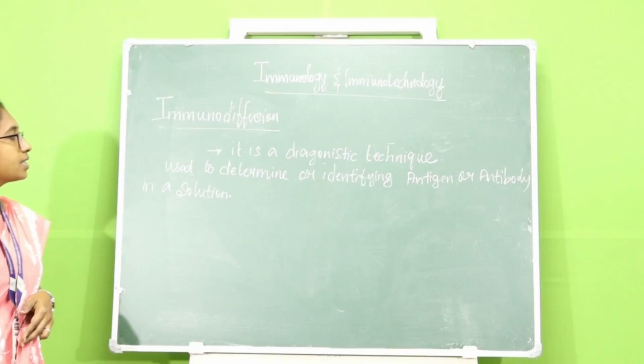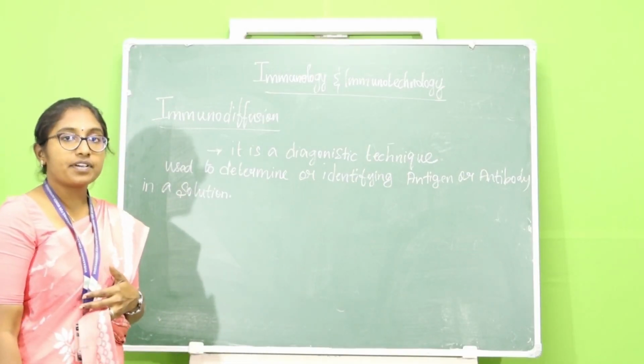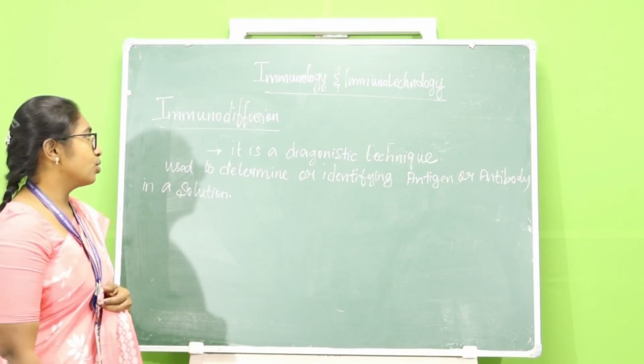It is usually used to determine the presence or concentration of an antigen or antibody in a solution.